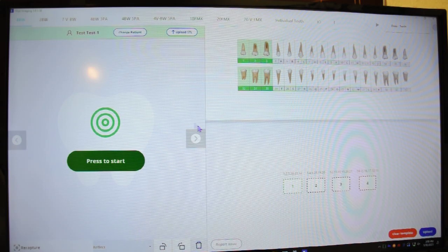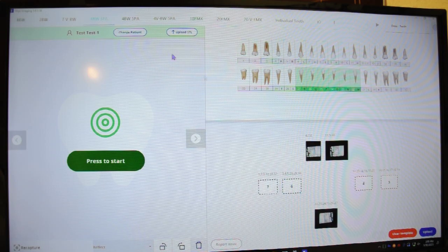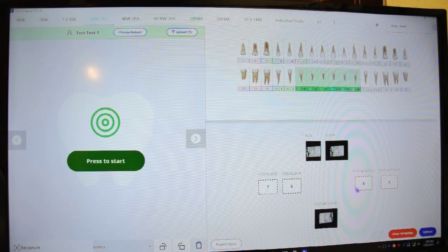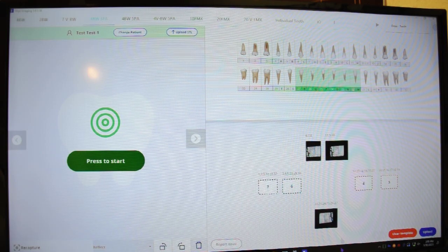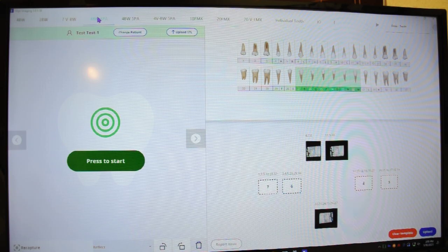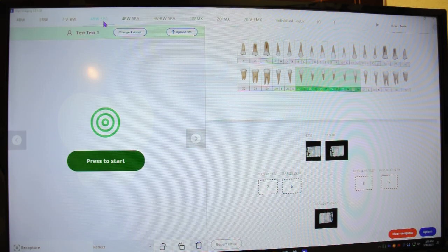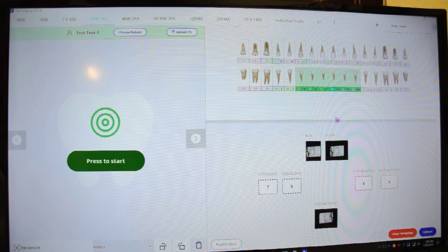They have four bite wings, and for our office, what we typically do is the four bite wings and two PAs. They have three PAs instead. So I think for hygiene, we'll do the four bite wings and three PAs.